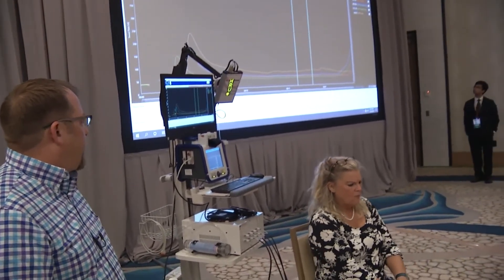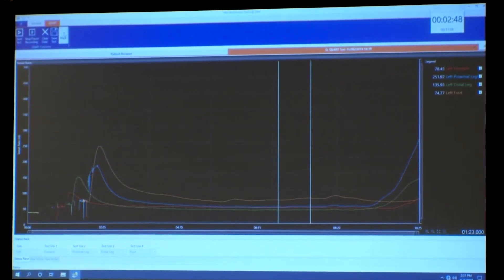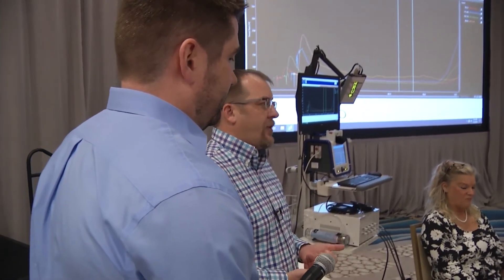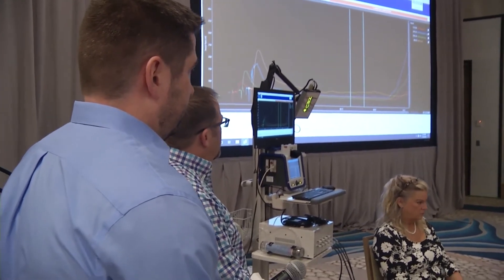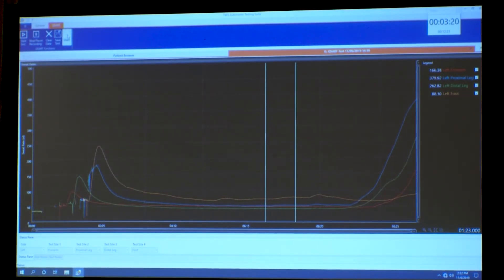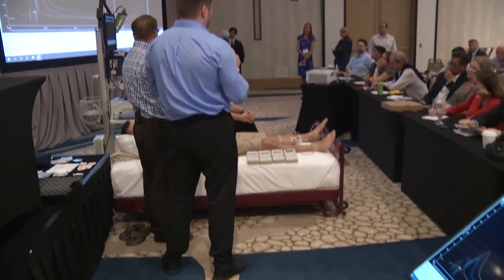We're starting to see the responses on the screen. The stimulus feels hot and prickly — burning nettles or itchweed are terms I've heard, and some describe it as a tattoo, though I think a tattoo is more intense. A TENS unit is probably a good example to help patients understand what they'll feel. We'll let this go for another two minutes; once it hits the five-minute mark the stimulators beep and turn off. Jade will then rest for an additional five minutes. The analysis integrates the positive response during the five minutes of stimulation and five minutes afterwards — ten minutes total.